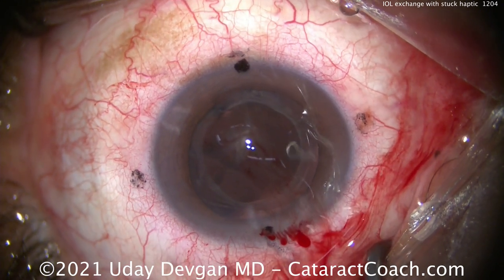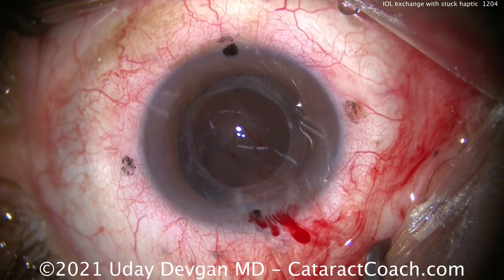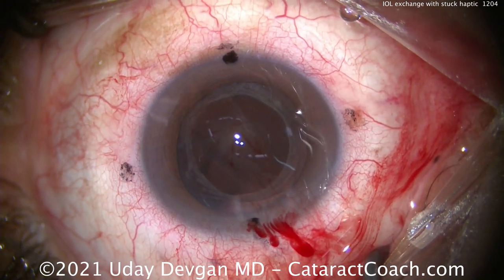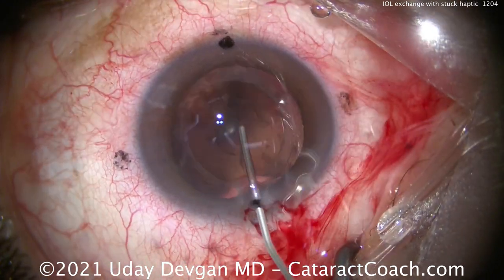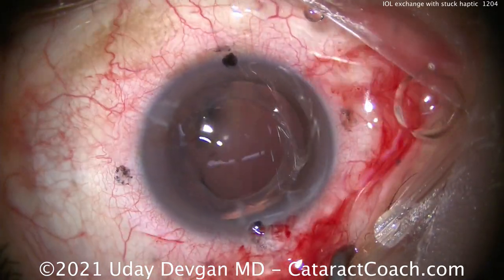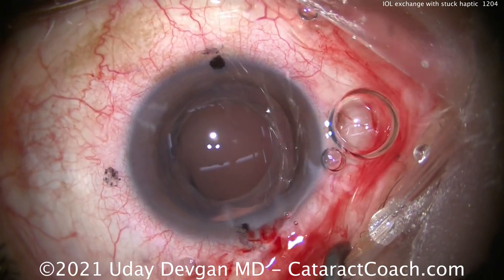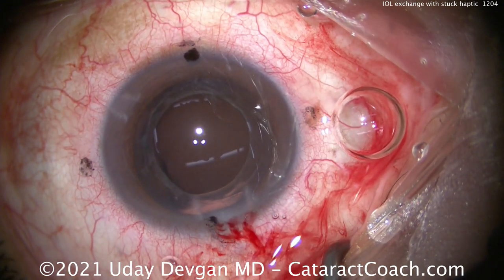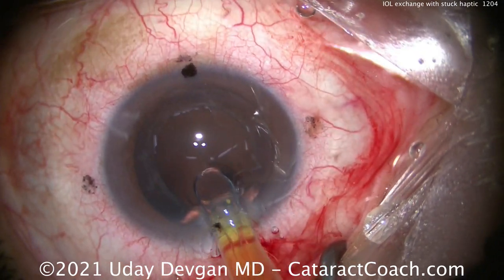Let's implant our new lens. This patient wants a monofocal lens — this patient desires the best image quality. I've not seen any kind of light-splitting technology, any kind of trifocal, bifocal, or similar lens that gives better image quality than a monofocal lens. So if you value the highest image quality at the focal point — far distance or plano — you definitely want the monofocal.